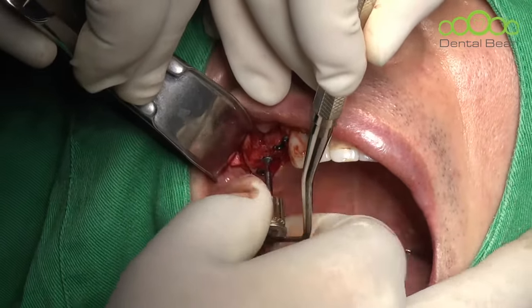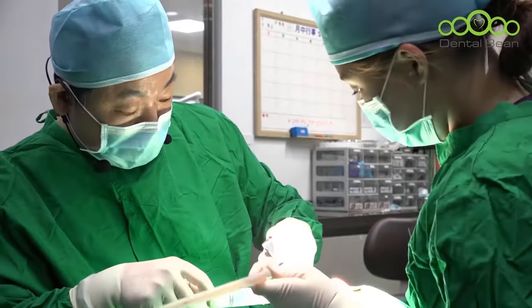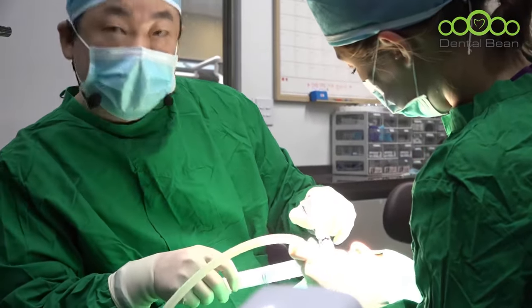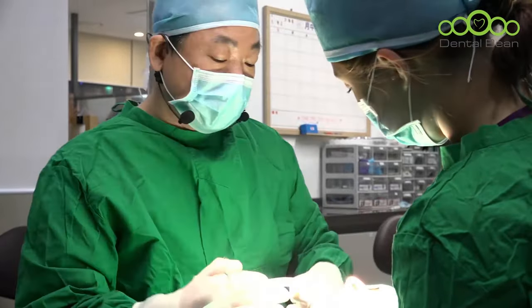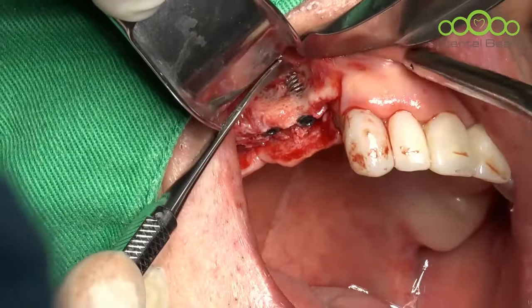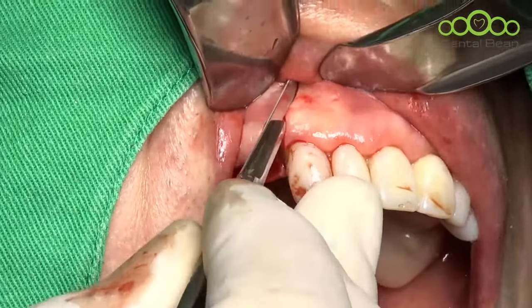Hold lightly. Okay, let me check the condition. Irrigation. Even though I tried this split, the buccal side looks narrowed. Okay, show me. Because of the buccal concavity, it looks like there is a fenestration in here, here. Vertical. This is an unexpected situation, so I need a GBR in here.